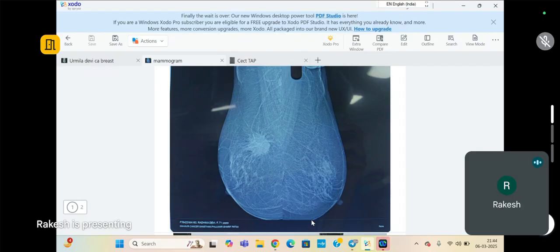Then pleomorphic and microcalcification will be at the end, and what is left? Linear branching or amorphous pattern, and then microcalcification. Okay, fine. Yeah, calcification is that. Then next, did we leave anything in mammogram? I think we discussed.